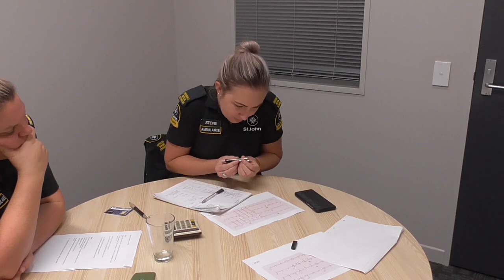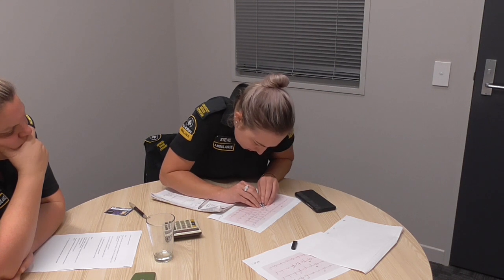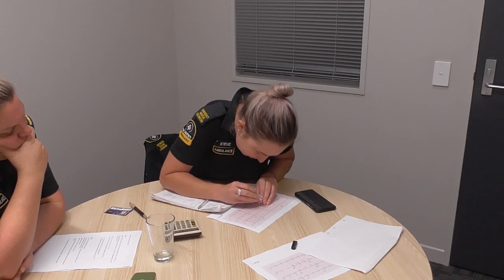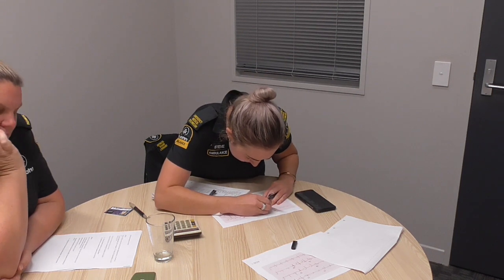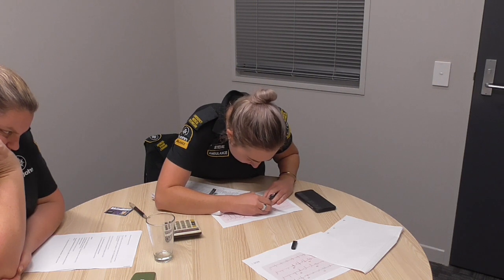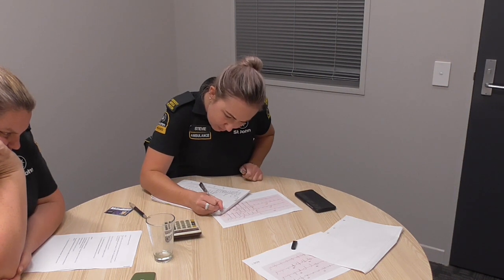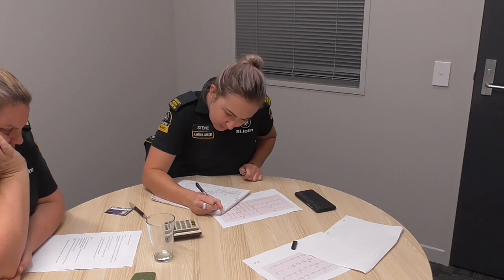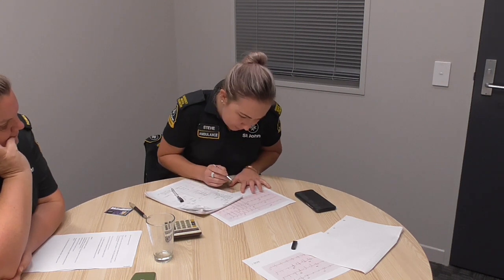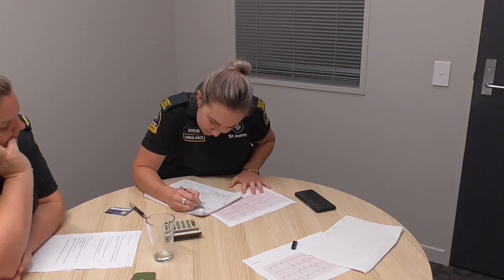PR interval is 0.16, so that's normal. There's a P wave for every QRS complex, so that's ruling out any higher degree heart blocks.